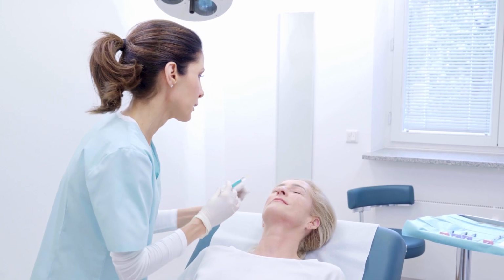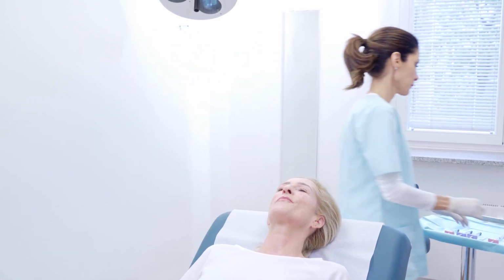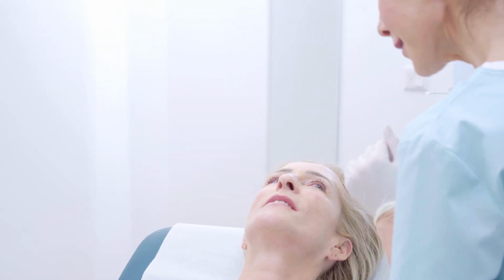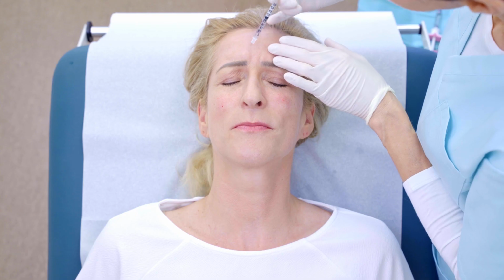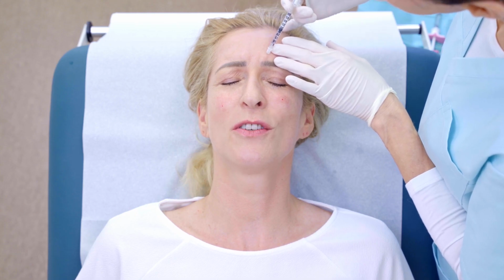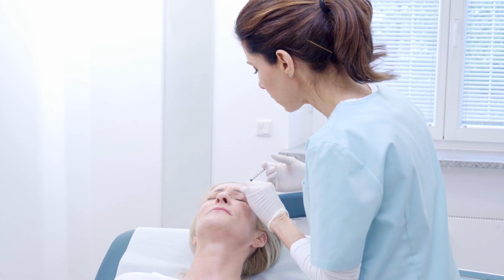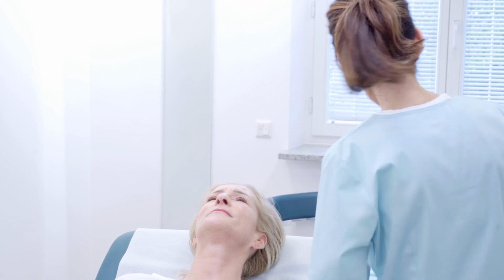While the small dose of anesthetic is doing its job, I'm preparing the areas we have planned for Botox injections. I interact with the patient to give me some mimic and gestures, in this case a very angry frown, to activate the relevant muscles and allow me to identify the precise spots where to place the Botox for optimal effect. The needles I use are extremely thin and, for various reasons, do away with the need for anesthetics.